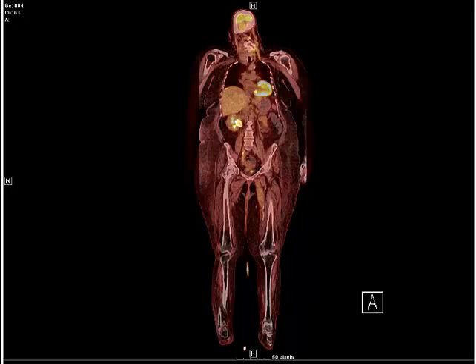and be careful and mindful, because these patients now, the technologist has to go up to the room and survey, make sure there's no contamination and leaks and things like that. So I'm sorry, back to a little side note. Back to this patient. This is a relatively clear scan.